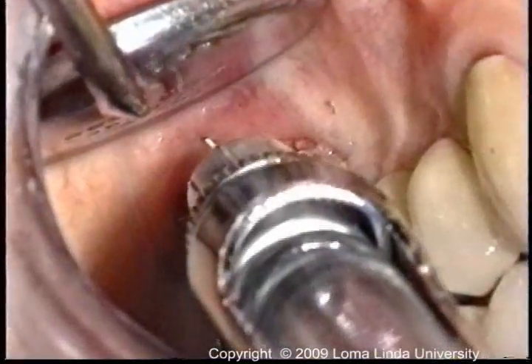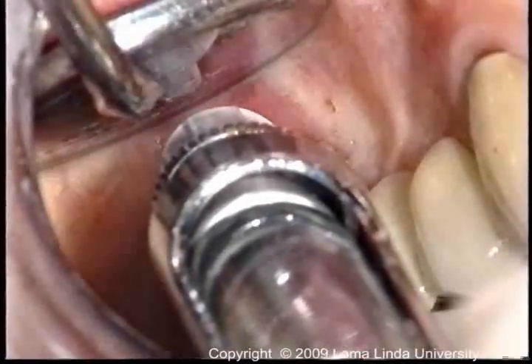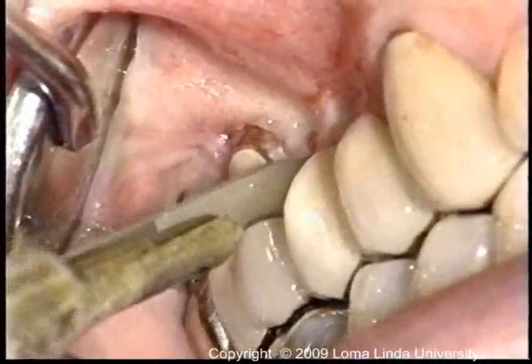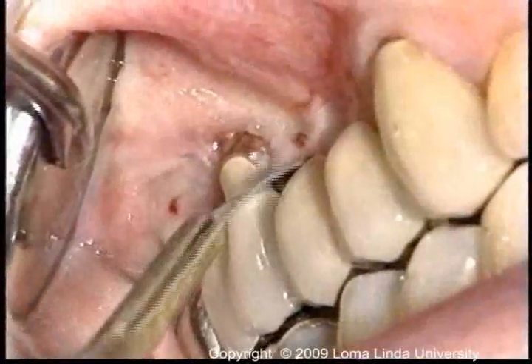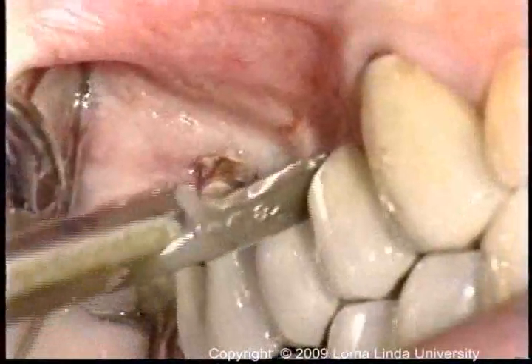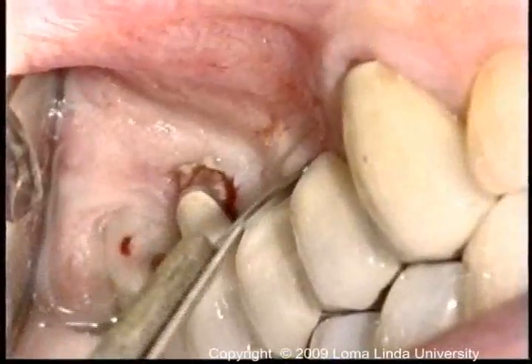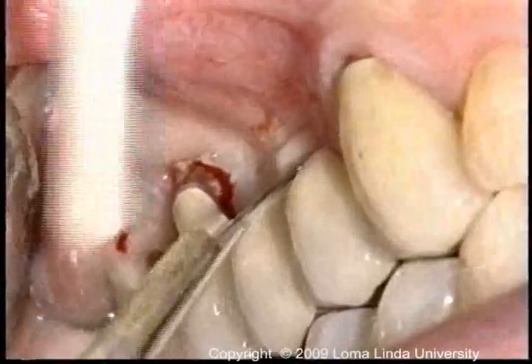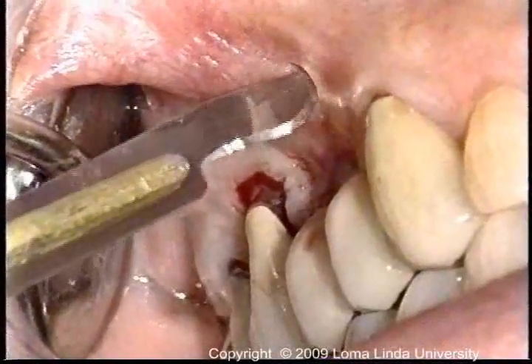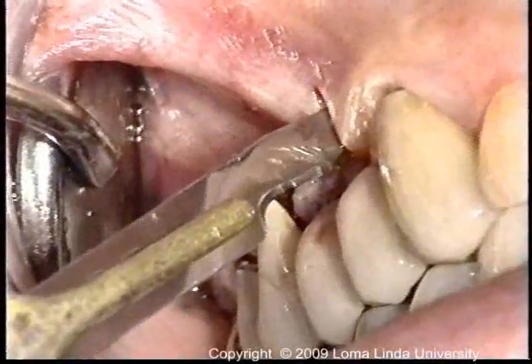Infiltration anesthesia of lidocaine with 1 to 50,000 part epinephrine is administered. A 15C scalpel blade is used to carve the intrasulcular incision from the distal line angle of the first molar anteriorly to the base of the pontic in the first and second premolar region. A vertical relaxing incision is made anteriorly at the mesial line angle of the pontic.